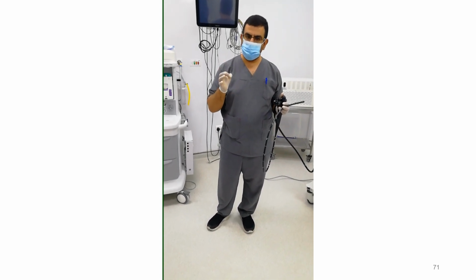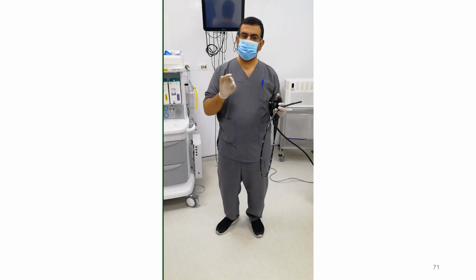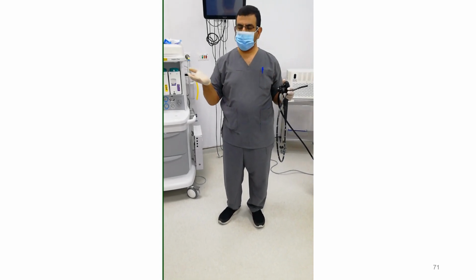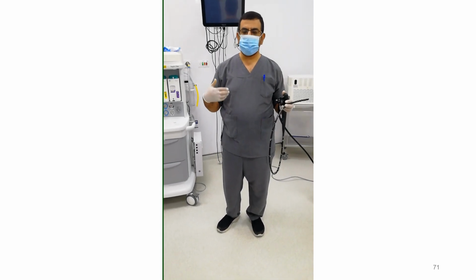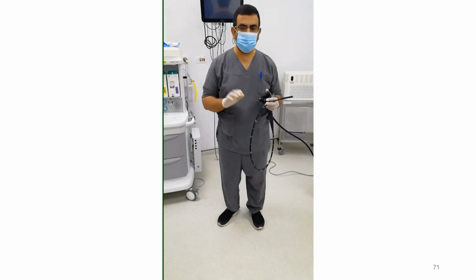فعشان كده لما توصل للنقطة دي، أي فلويد عندك لازم تشفطه بالكامل. خلاص كده اتفقنا؟ أنا شخصيا من أنصار لما أجي أعمل منظار أخلي العيان على زاوية 30 أو 45، فبقلل حكاية إني أعمل ريفلكس في العيان، يكون مستريح، خاصة لو كان العيان بتاعي عنده مشكلة. خلاص كده اتفقنا؟ يبقى دي نقطة مهمة.